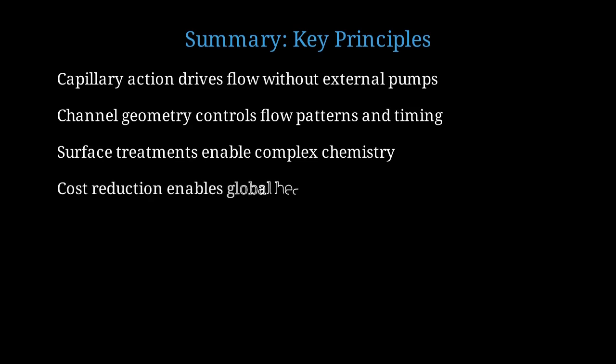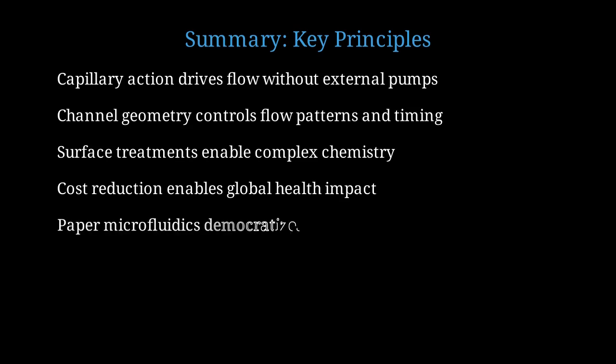The dramatic cost reduction, from dollars to cents per test, makes diagnostics accessible to billions of people who previously had no access. Ultimately, paper-based microfluidics democratizes diagnostic healthcare, bringing life-saving tests to the point of need, regardless of resource availability.